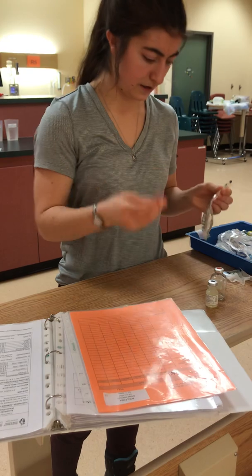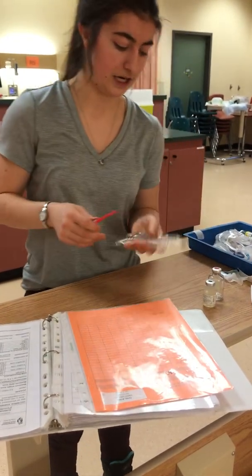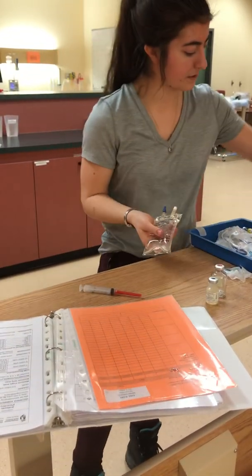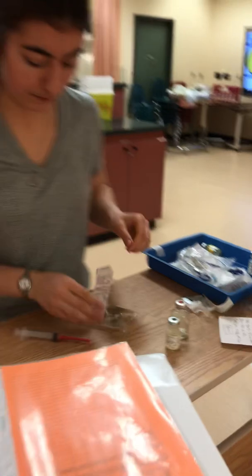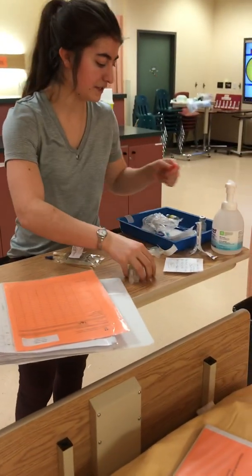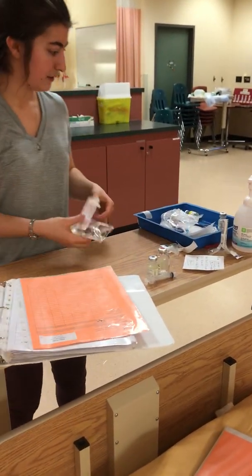And then I'm going to shake this a little. I have a label already prepared for the sake of the demo. You can come and check. And I'm going to put this in the sharps and all of these into medical waste.